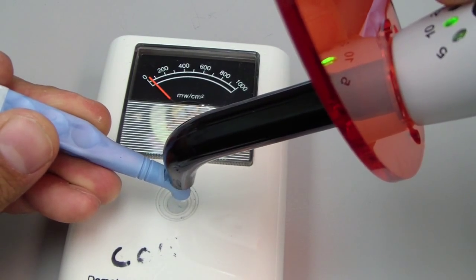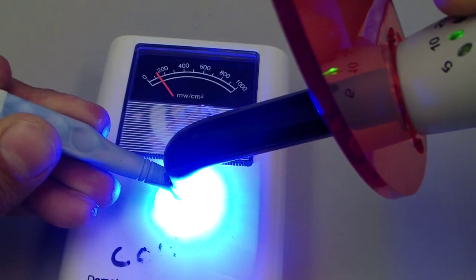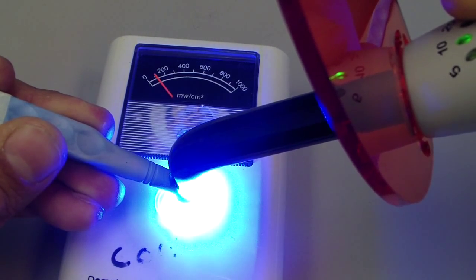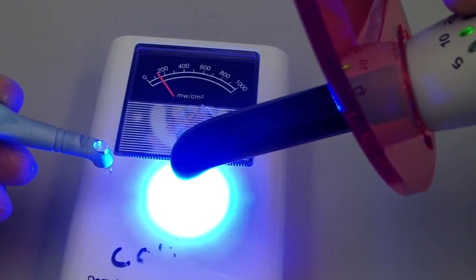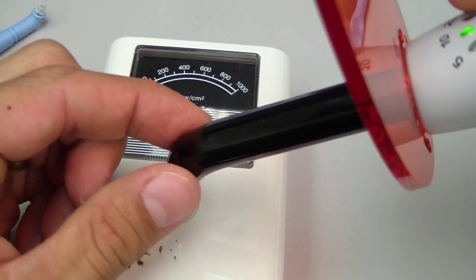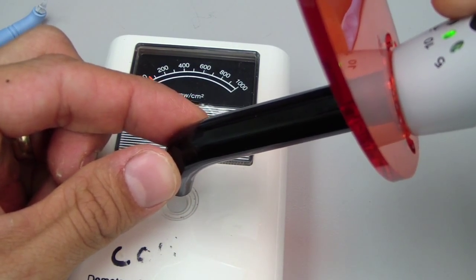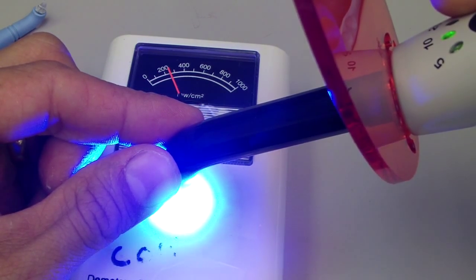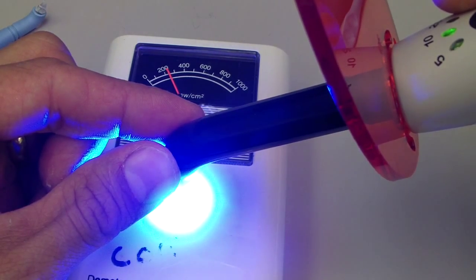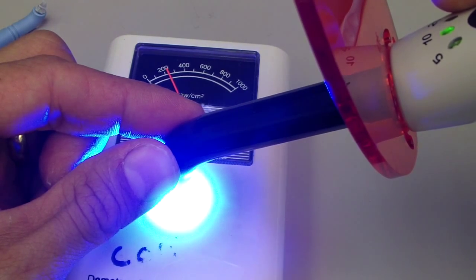Let's try just without that little instrument tip. Even with ambient light it doesn't make a difference. So approximately — it's almost in the way. It's almost inhibiting our light transmission.